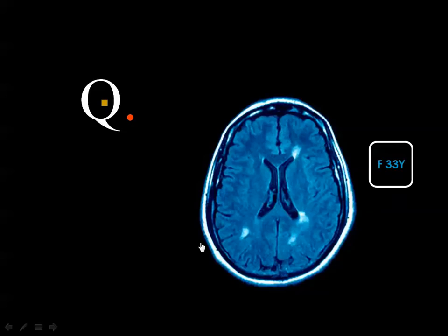Axial FLAIR image of the brain in a patient 33 years old, showing multiple periventricular white matter foci of high signal in the FLAIR images exerting no mass effect and are not surrounded by edema. The diagnosis is MS.